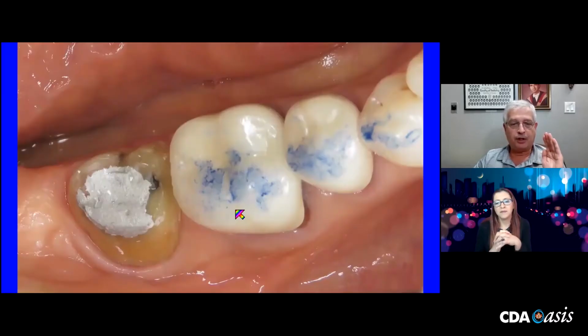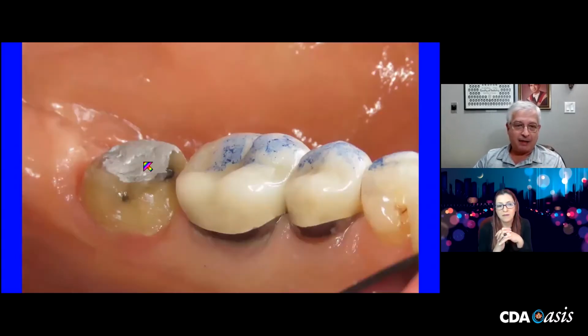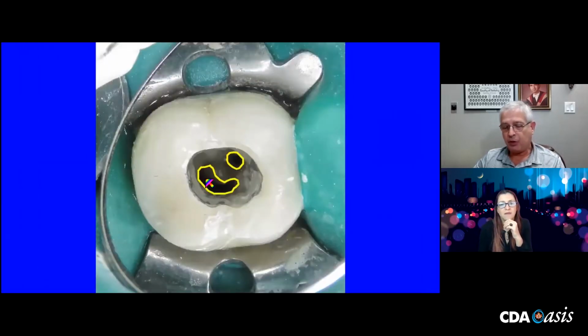And it's important in this case because that's an amalgam plug. There's the lingual surface, but that's an amalgam plug because I had to do endodontic therapy for this tooth prior to making the crown to a pre-existing crown. And it was a difficult endo. I had a mesiolingual root and I had a mesial buccal and the distal were webbed together.